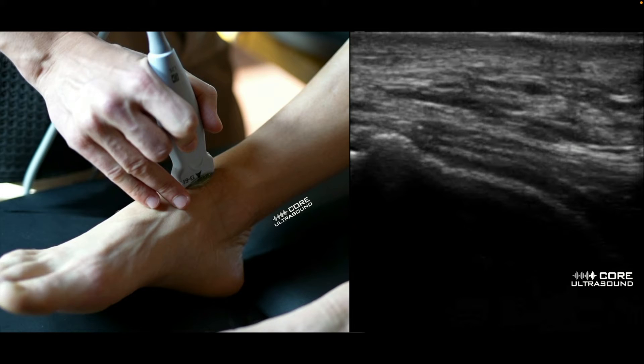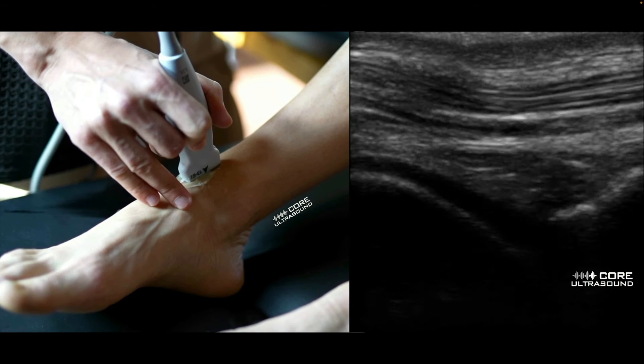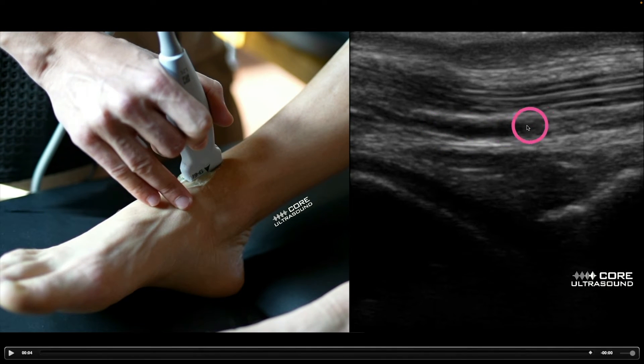Irrespective of whether you are aspirating or injecting into that ankle joint, be very careful not to puncture the dorsal artery that sits right here. Just throw some Color Flow on there, usually in the short axis, to help identify exactly where that is and try to avoid it.